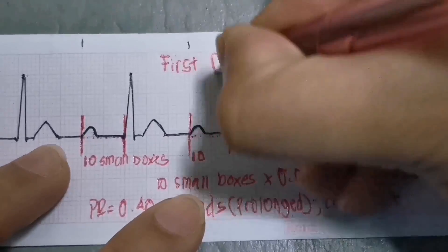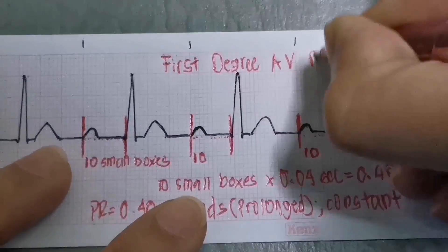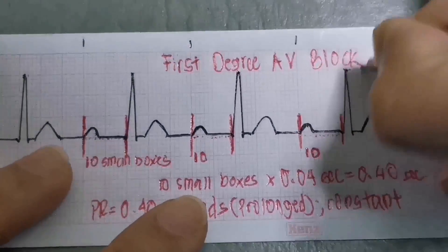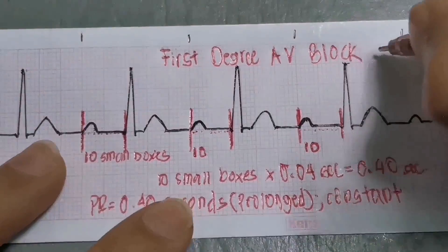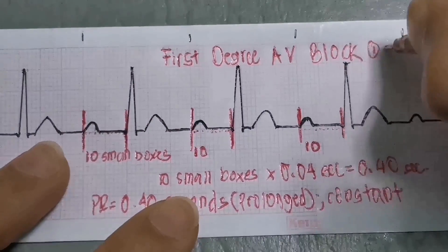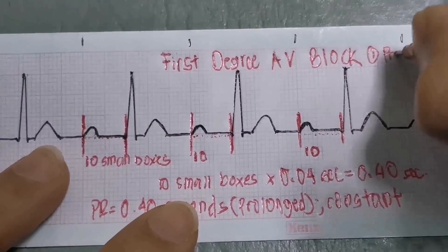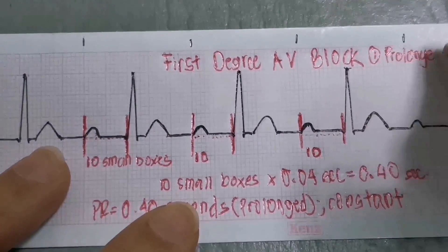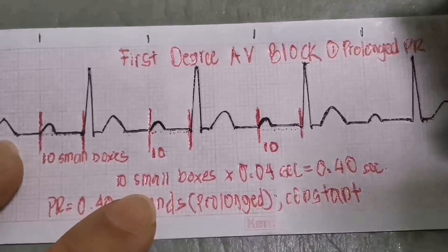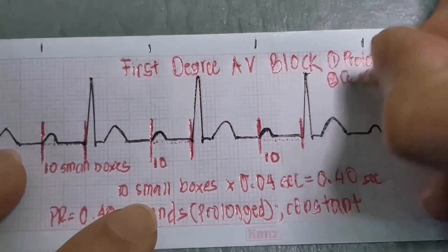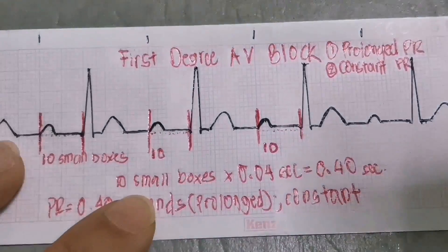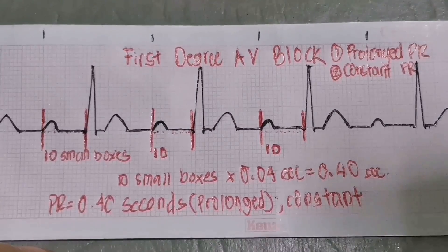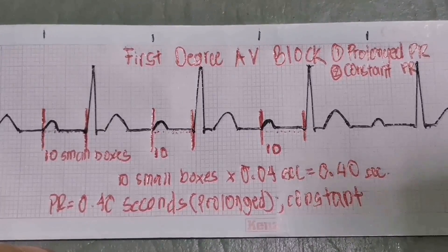We conclude that this rhythm is first-degree AV block. There is a prolonged PR interval, and the PR interval is constant in the remaining beats.